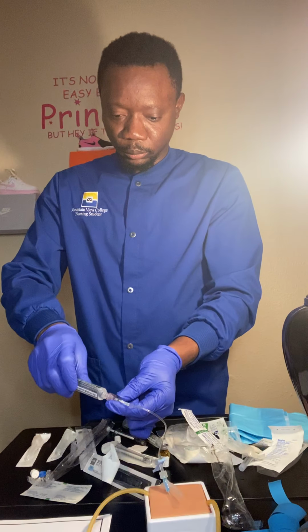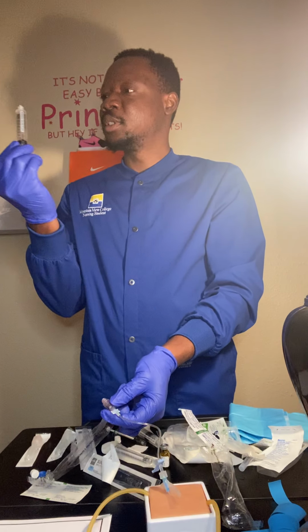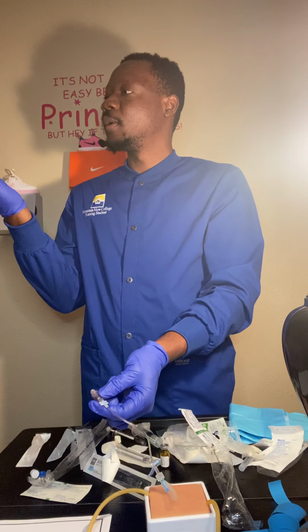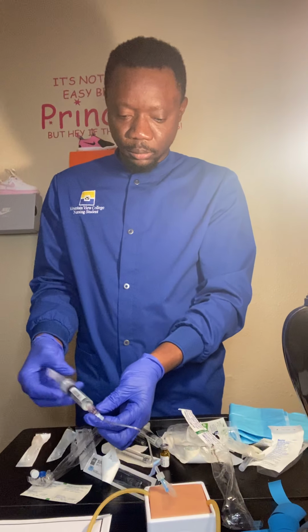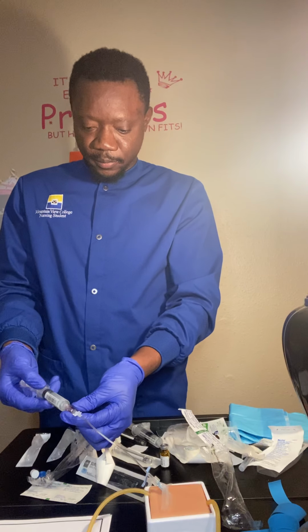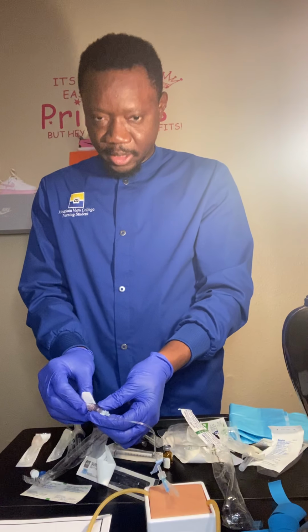Screw it. But before I screw it, I make sure I reduce air bubbles. Okay, then screw it. Flush it with 2 ml of normal saline. Then I unscrew it. Clean it again with a brand new alcohol swab.